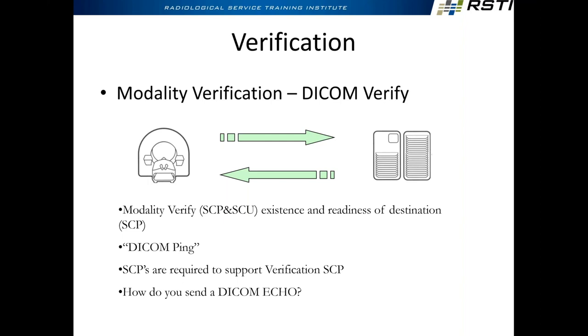What if the echo works, but sending an image to PACS doesn't work? Think about that for a second. Can't be echo, right? It's not a configuration problem because the echo succeeded. So what did I say echo does? The handshake, but doesn't exchange any data, no data. What's DICOM store doing? Sending an image. Give me a reason why a PACS would reject storing an image.